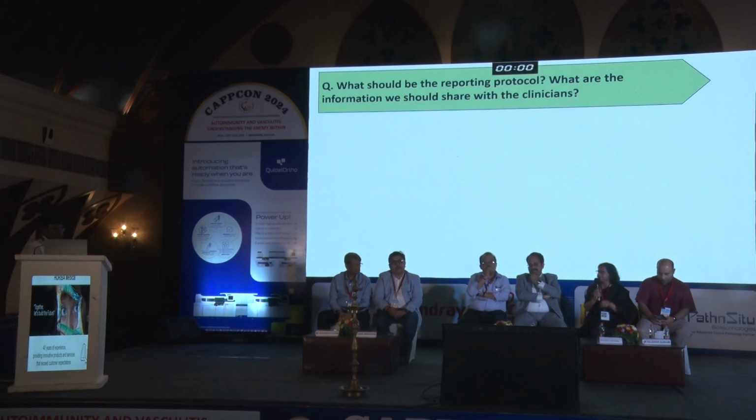In the tubulointerstitial compartment, the chronicity and interstitial fibrosis and vascular lesions, whether there are hypertensive changes or diabetic. Right. And we have to combine all these LM findings with the immunofluorescence features and give a final report.